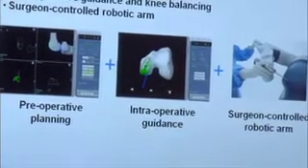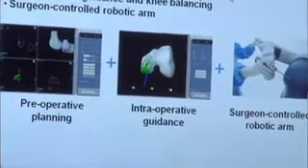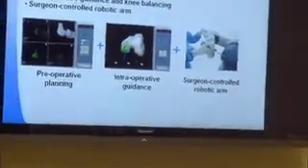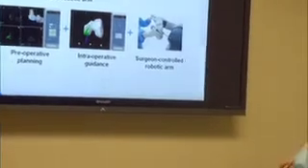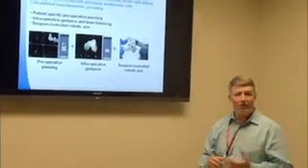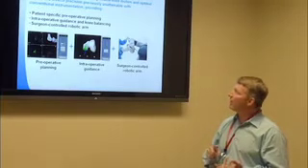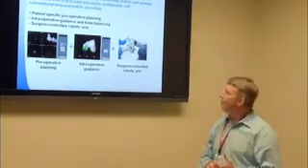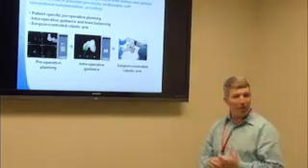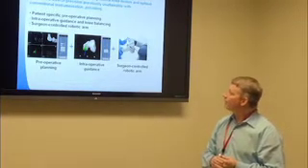That's right. So the Rio, that's the robot. It assists the surgeon in treating. I'm sorry. That's okay. It helps the surgeon achieve the natural knee range of motion and allows a level of precision that we previously could not attain prior to this with conventional instrumentation. It's patient specific. It's with the preoperative CT scan that we get. The intraoperative guidance and knee balancing, that's what I'm doing during the surgery. That's why I don't go play golf when you're having the surgery and let the robot do this thing.